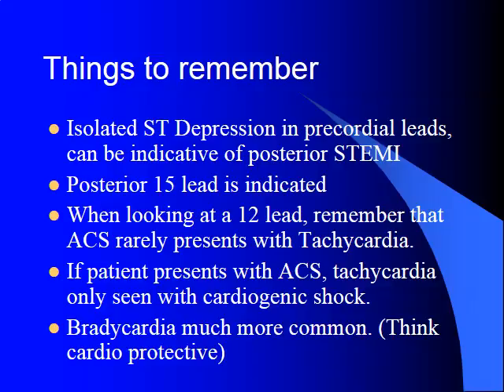Remember that when we are looking at a 12 lead, acute coronary syndrome very rarely presents with tachycardia. Generally, patients that have an MI and are tachycardic, we're only going to see that when they are in cardiogenic shock. So if we have patients that are hemodynamically unstable, it is a possibility that it could be from an MI if they're tachycardic. But generally, think of other situations before you're pointing to STEMI in tachycardia.